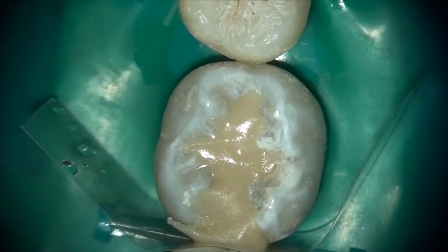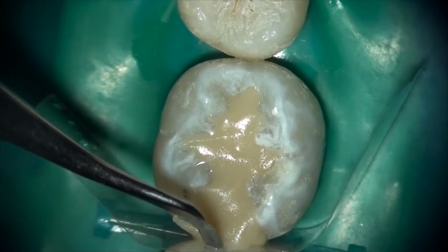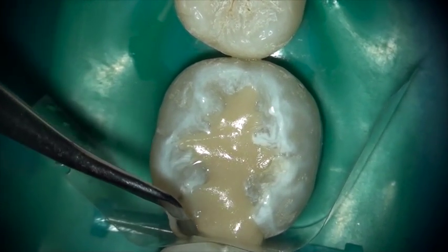Notice how well it holds its shape, does not slump, stays where it's put. It is a restorative dentist's dream.